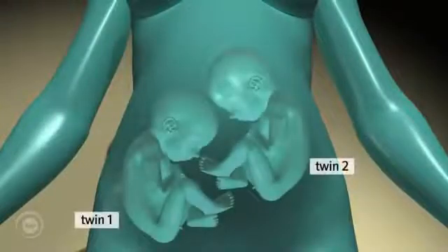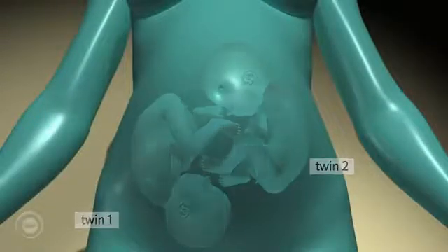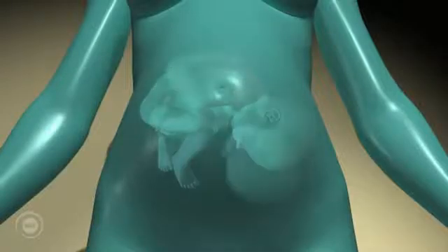In the case of breech twins, the same principle applies. The twin with the lowest most breech will be described as twin 1. Clearly, in some instances, twin 1 may be cephalic and twin 2 may be breech. The lie of the twin refers to whether the twin is in the longitudinal, transverse or oblique position.